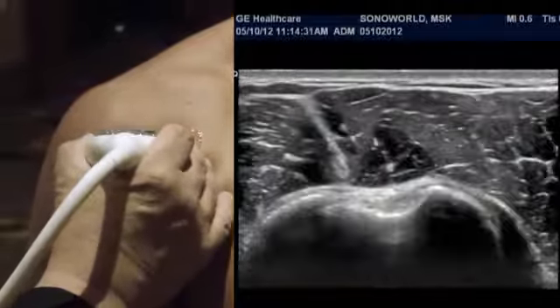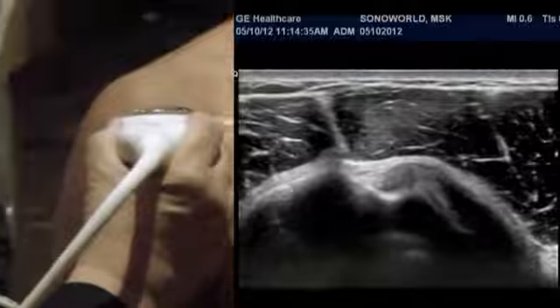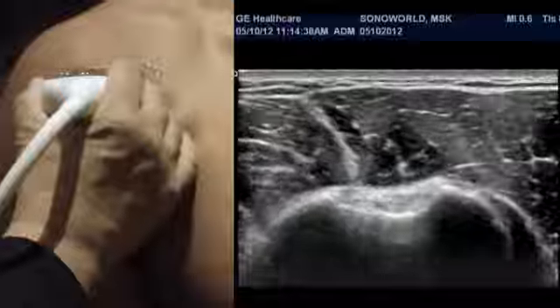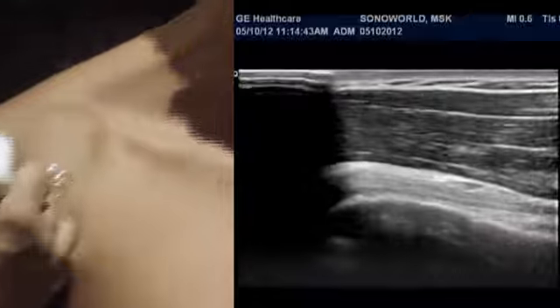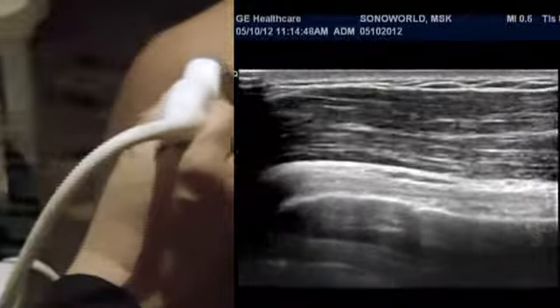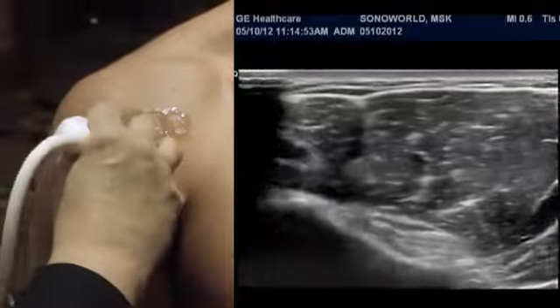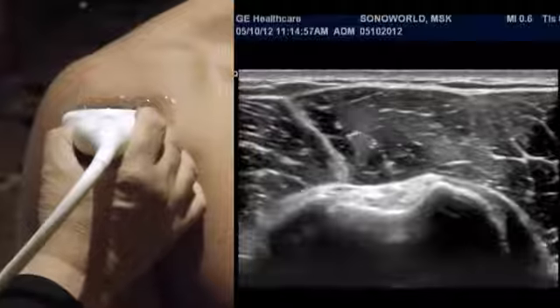We're going to first test the location and the stability of the long bicipital tendon in short axis mainly, but it's always important to recognize that this has a fibrillar pattern in the long axis, therefore is compatible with a tendinous structure.